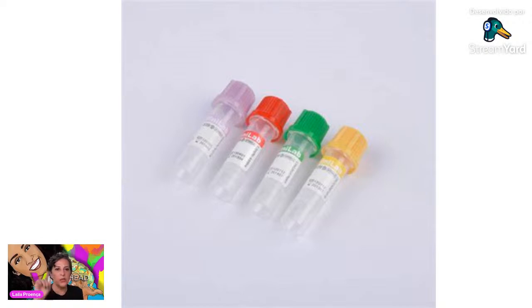microtubes. Those microtubes, see right here, are tiny tubes that come with EDTA, come with heparin, come with serum separator, or they come empty, right? But instead of those big tubes where we need to put 1 to 2 mL of blood at a time, now we have microtubes that we can use. Usually, request them from the lab. You don't need to buy them. In all the countries I've been so far, the lab is the one that is able to provide this for you. Otherwise, guys, Amazon's there, you can buy it. But usually you need to put about 0.25 mL of blood. And it's really important that we put the minimum amount of blood, guys, because otherwise it's going to dilute the sample. We can't really trust the results.